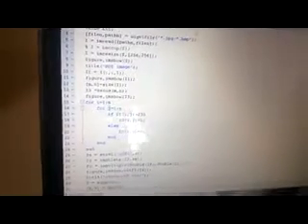If the pixel value is greater than 230, the I3 value will be 1. If it is less than 230, the I3 value will be 0. From that we segment the disc by multiplying the original image with the dilated image. Here we have the dilated image. Here we multiply the dilated image with the original image. Then we get the segmented disc.